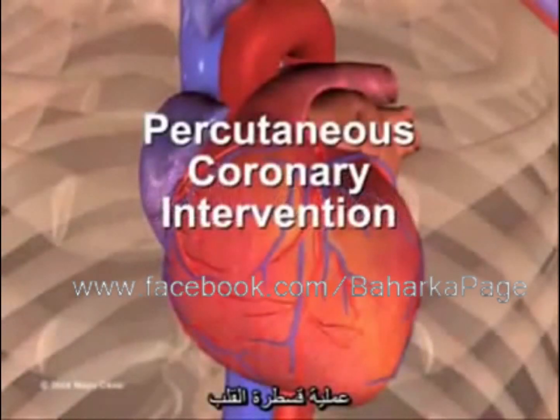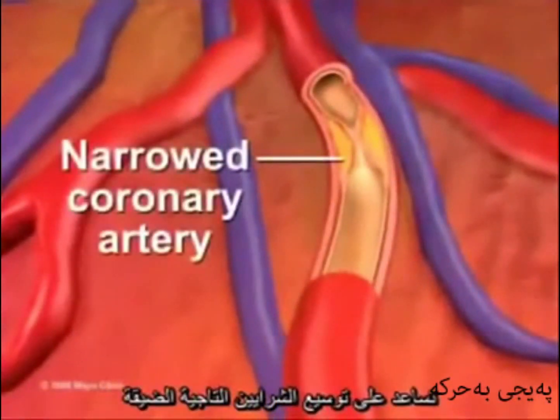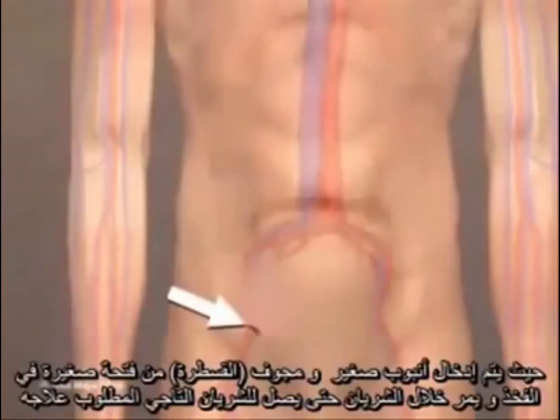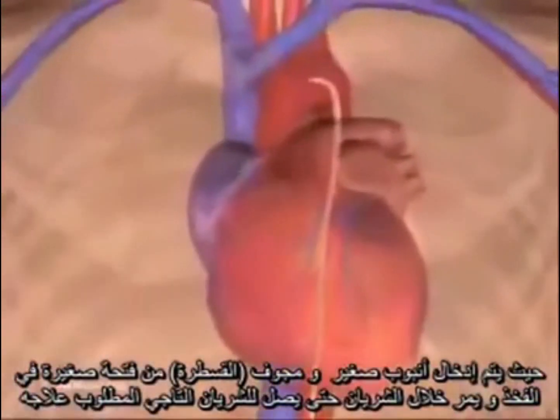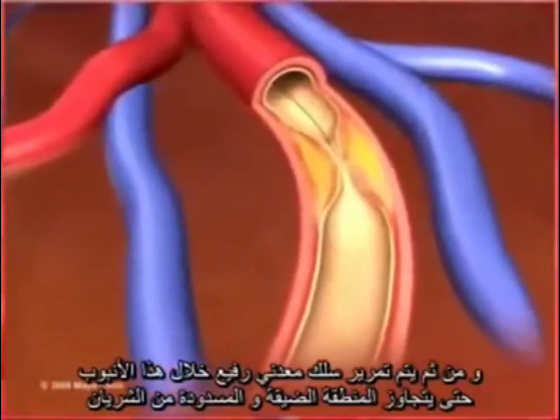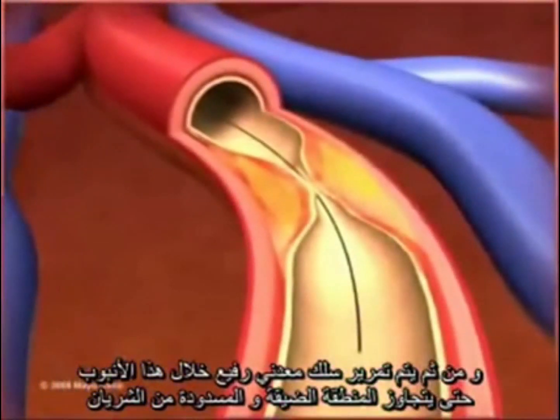Percutaneous coronary intervention, also known as coronary angioplasty, opens narrowed coronary arteries. A small, hollow tube called a catheter is inserted into an artery in the groin or arm and threaded to the affected artery. A thin, flexible metal wire is then advanced through this tube and past the site of blockage in the artery.